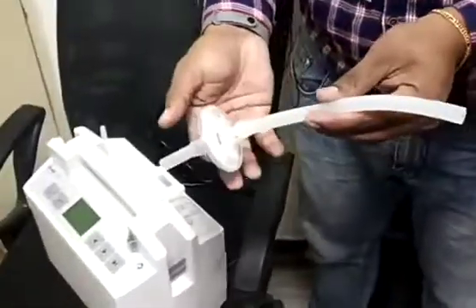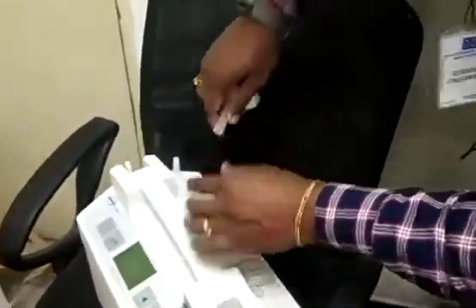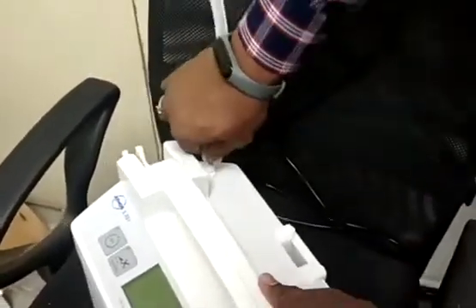First, you have to connect this filter to the machine. See that? It has to be fixed like this, from here. So it has to be fixed like this.